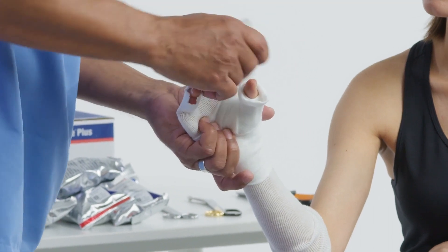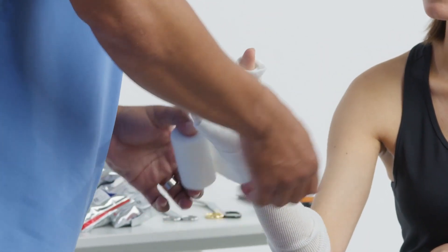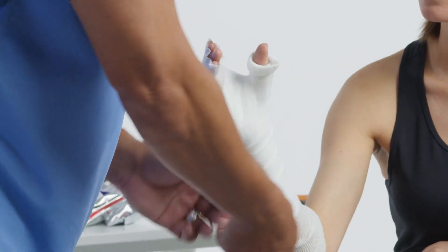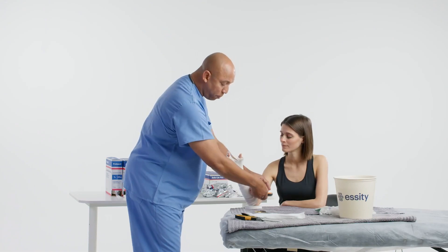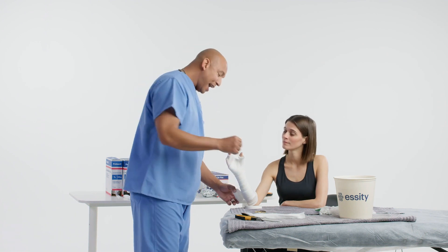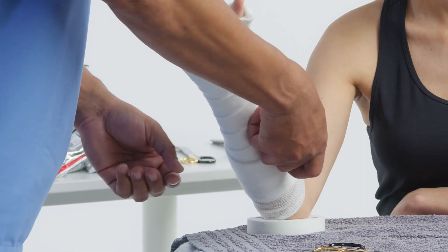Then I do it again, and start working my way proximal, doing what we call 50-50 coverage — every revolution around, I'm going to cover 50% of what I just put on. We're going to have a minimum of two layers, max of four, but we're going to palpate over the extremity, especially the bony prominences, and visually check for any thinness of padding. Because this is a cast, we've got to be really conscious that our padding is correct and wrinkle-free as much as possible.